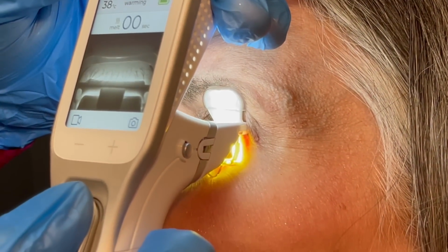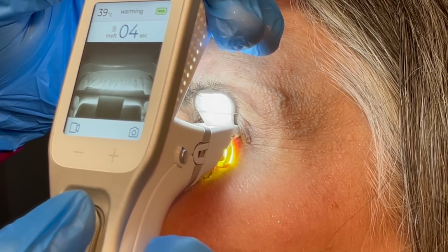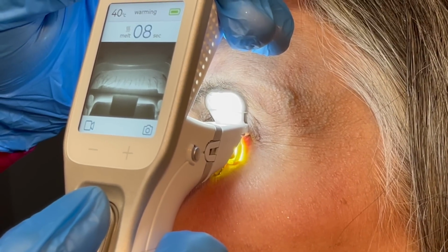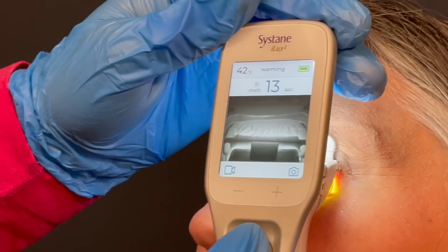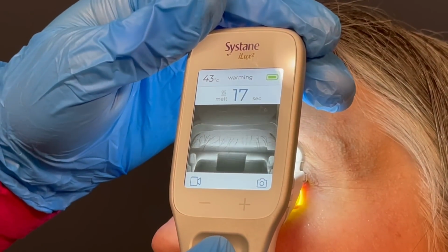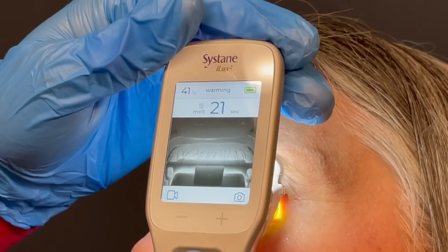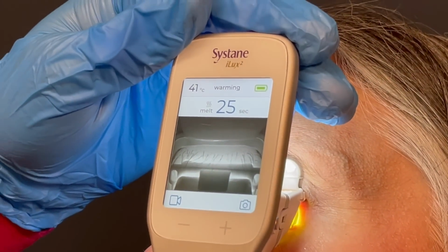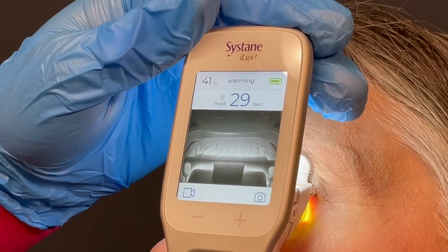Does that feel okay for you? Mm-hmm. Okay. There's been some patients that have had this done that have had some hardened oil that's only come out like toothpaste, not like warm olive oil. So the more olive oil we can get, the better this is going to be. But if it comes out like toothpaste too, it's still going to help you feel really good. Mm-hmm. But we haven't seen toothpaste hit on you at all, Mom.